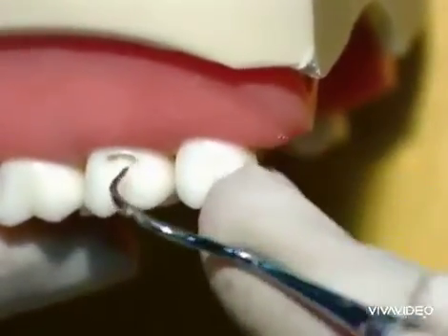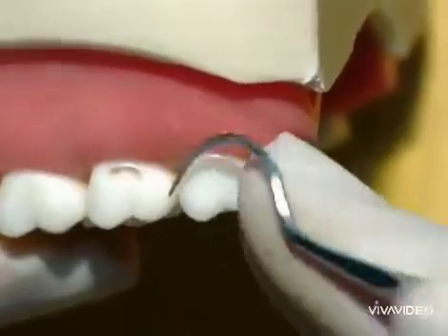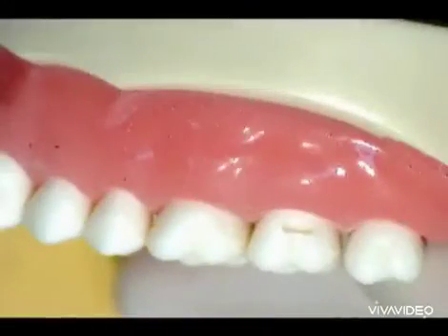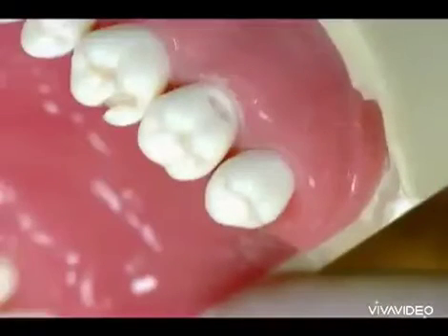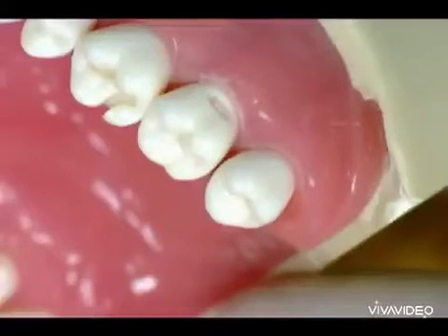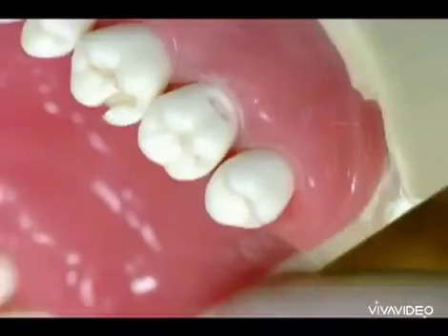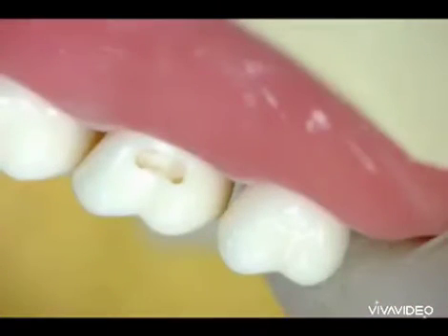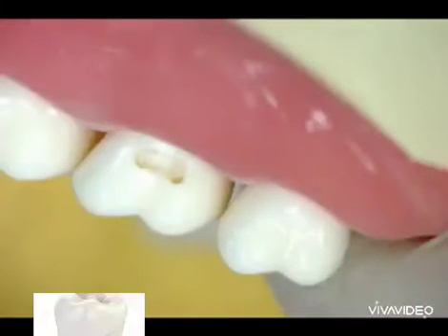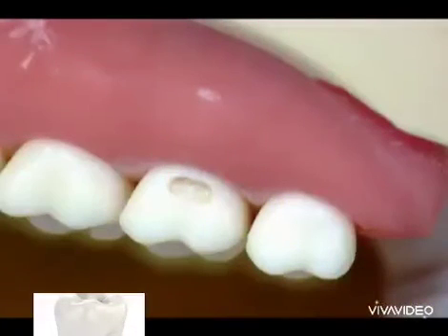Further tooth reduction is not necessary — it may result in pulp exposure or sensitivity at that area. This is the final shape of Class 5 amalgam cavity preparation of the upper second molar.